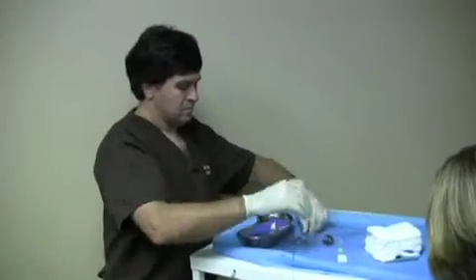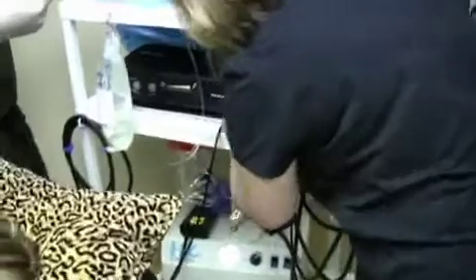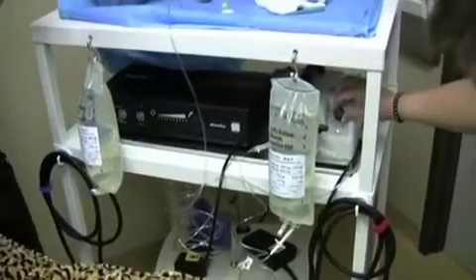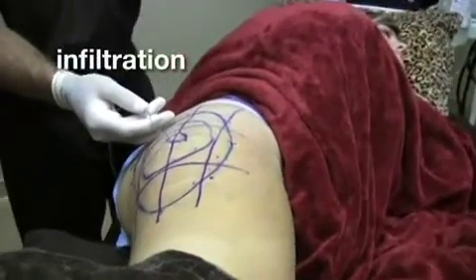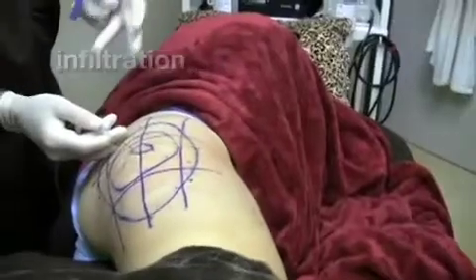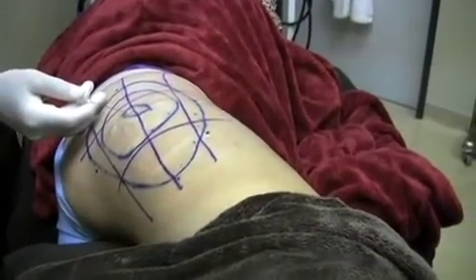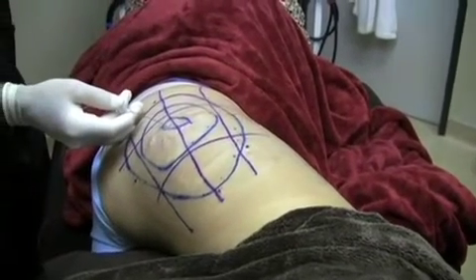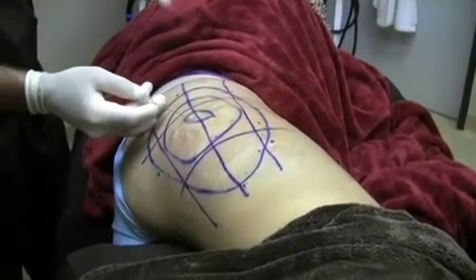And what's the purpose of infiltration? The infiltration has the numbing medicine, which is in this IV bag. It's got lidocaine, which is the numbing agent. It's got epinephrine, which vasoconstricts the blood vessels and minimizes bleeding. And just so you know, this area will be very distorted. We're going to put about 1 liter of the solution into this area, so the area will look very large. That is so that we expand the fat compartment so that it's easier to extract the fat.